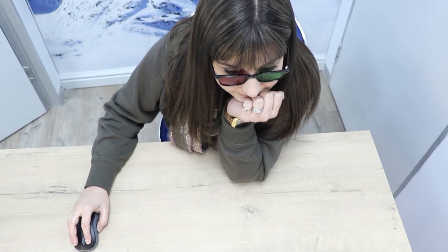Be very careful of multifocal wearers who habitually will lift their chins while working with a computer — that's just generally what they do, so just be sure they're not doing that. If we ask the patient to place their elbow on the desk or on the table and put their chin in the palm of their hand like so, this will adequately immobilise the head movements throughout the entire test. During the exam, it's essential that they hold this position exactly to eliminate any movements whatsoever.